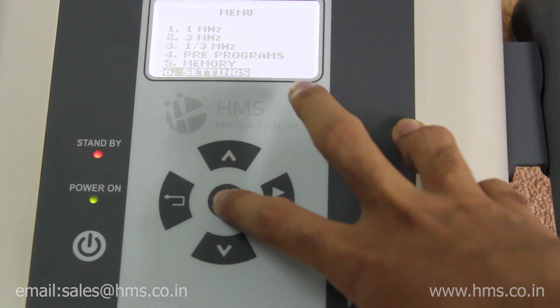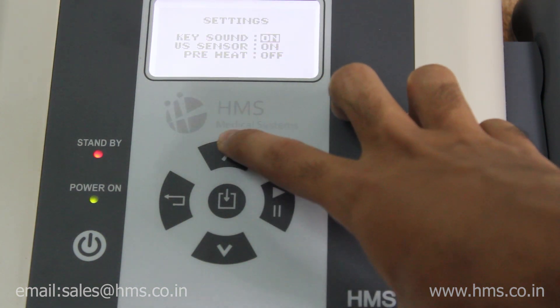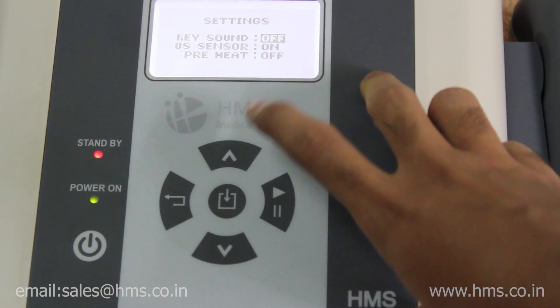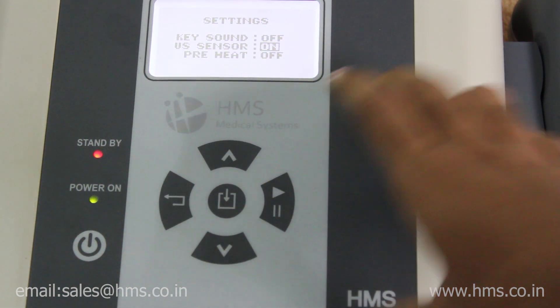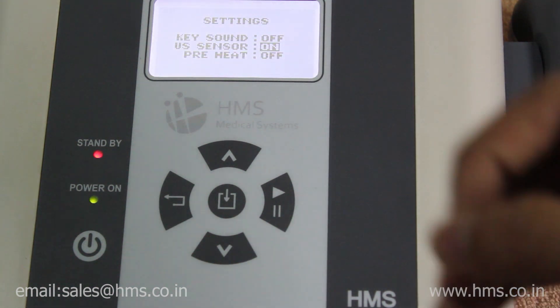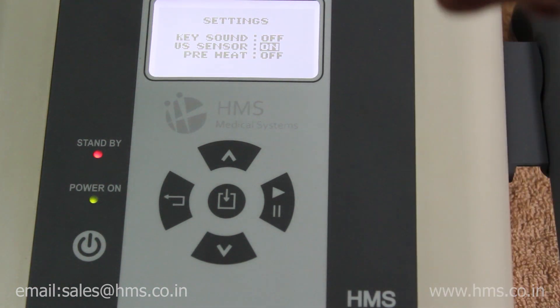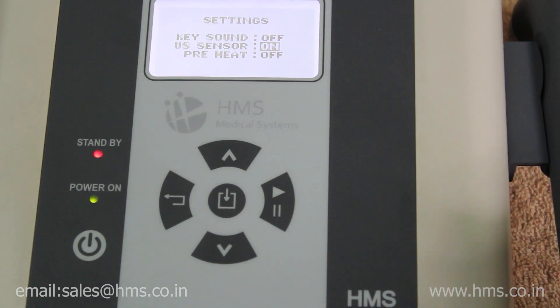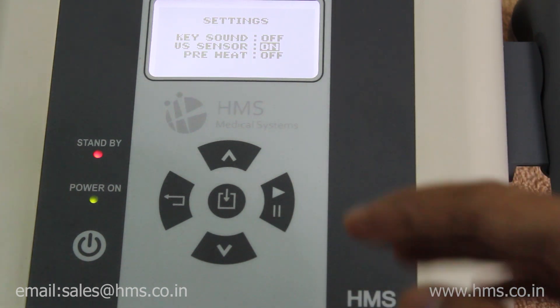In the settings menu, you can enable or disable the buzzer sound when operating the machine. There is also the US Sensor feature, which is the transducer's automated sensing feature. This can be enabled or disabled, but by default it turns on automatically every time the machine is switched on.